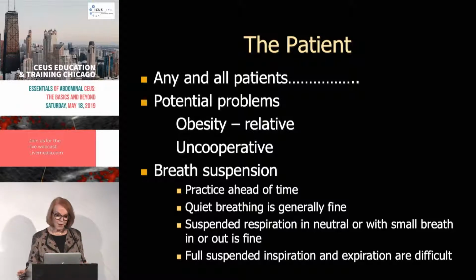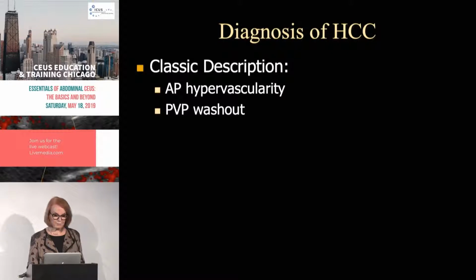And certainly, we do use full suspended inspiration, but it's very difficult for the patient to maintain. You can't see your dual screen as well. And suspended expiration is almost impossible for everyone. So really practice and make sure your techs know this before they get started.